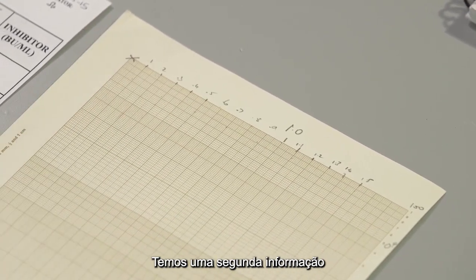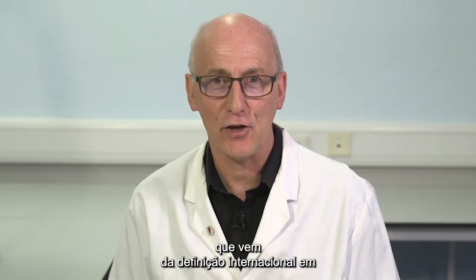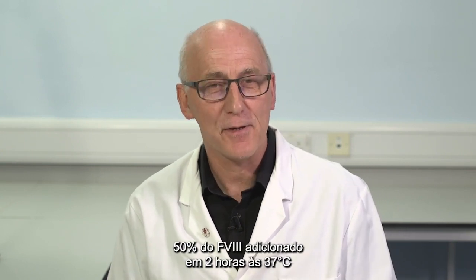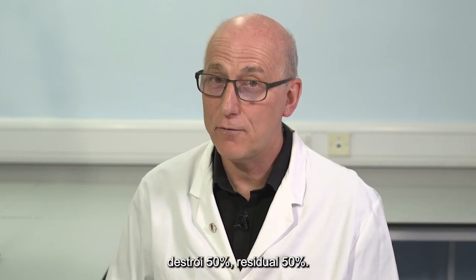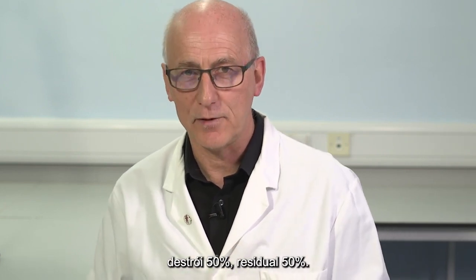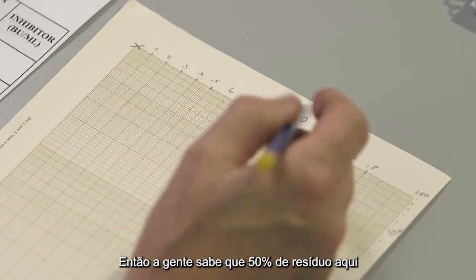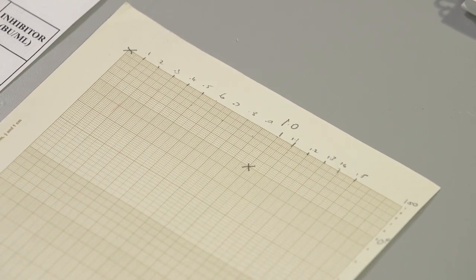We have a second piece of information, which comes from the international definition. 1 Bethesda unit per mil factor VIII inhibitor destroys 50% of the added factor VIII in 2 hours at 37. Destroys 50%, residual 50%. So we know that 50% residual here is equal to 1 Bethesda unit per mil.